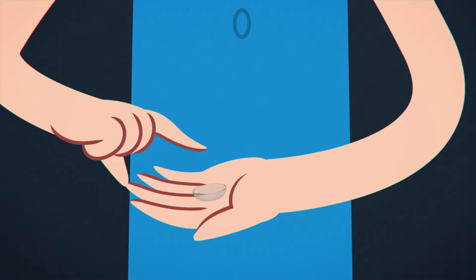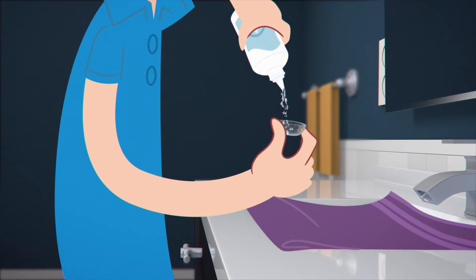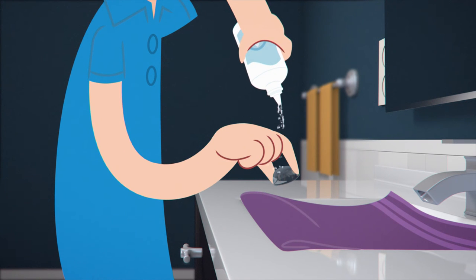Next, rinse. Pick up your lens by pinching the sides together, then squirt your solution over the lens and let it rinse both the inside and outside.